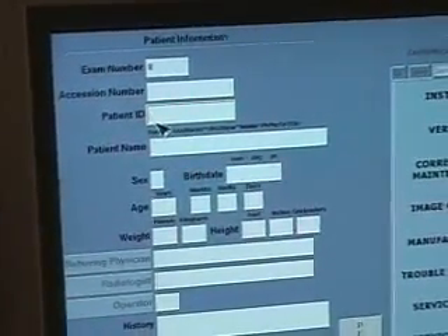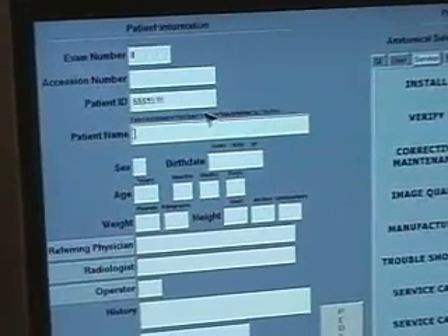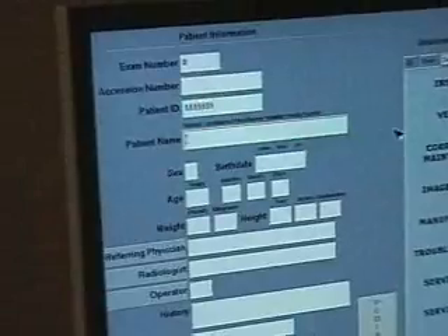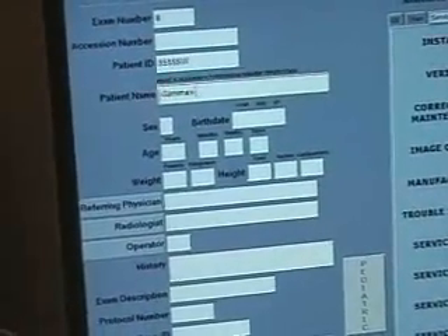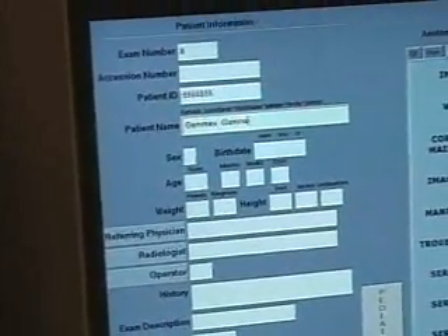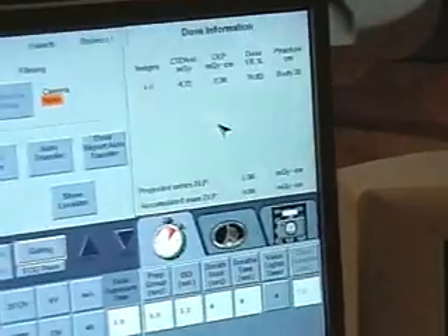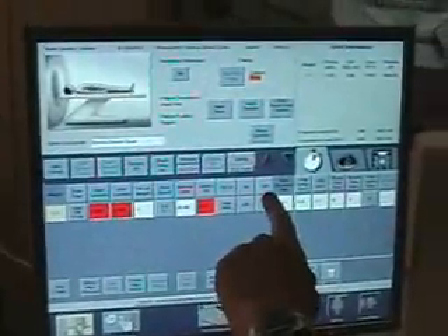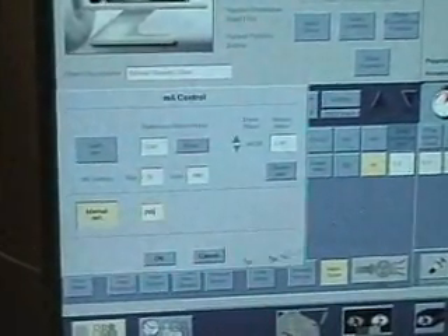Since we did one earlier today with ID 12345, we want something different, so we'll use 999999999. Now we need to enter the patient name — normally we put in GAMEX TEST, but since we did that earlier this morning, we'll just put GAMEX GAMEX so we can pick it out of the library. Then we come over and, since we are in service mode, we click on service generic scan. The milliamp here should be 200, so we click on that and enter 200, then click OK.